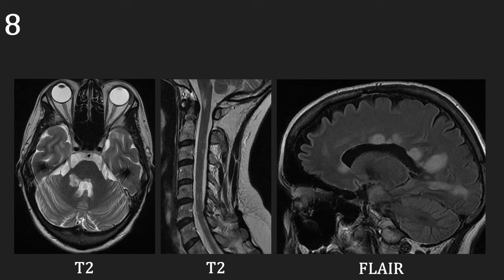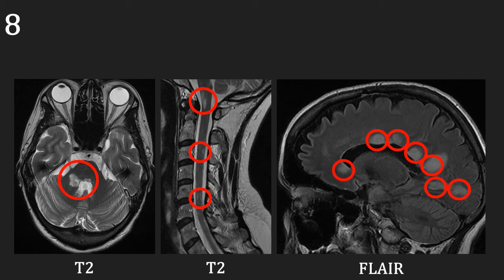Our next patient is a 44-year-old female who presented with double vision, dizziness, cerebellar signs, and hyperreflexia. This had been going on for several months and she underwent an MRI to investigate further. On the axial brain sequence, we can see a bright lesion next to the fourth ventricle, but also multiple lesions in the cervical spinal cord and perpendicular to the lateral ventricle. This is a case of demyelination or multiple sclerosis.